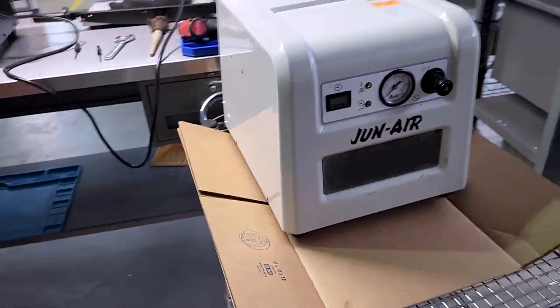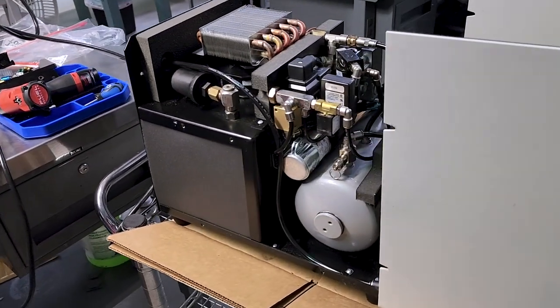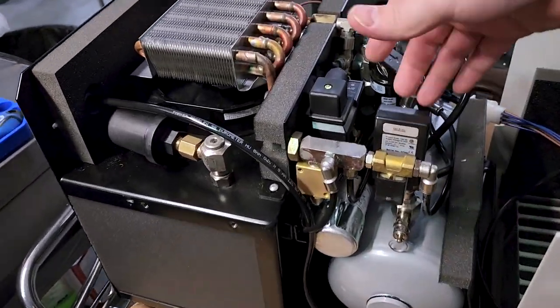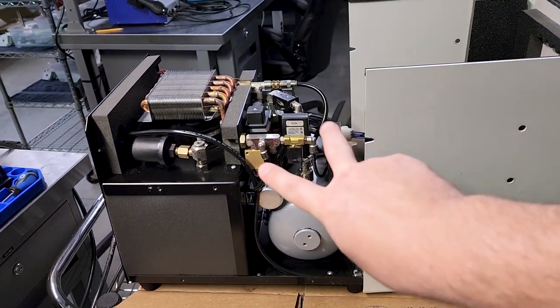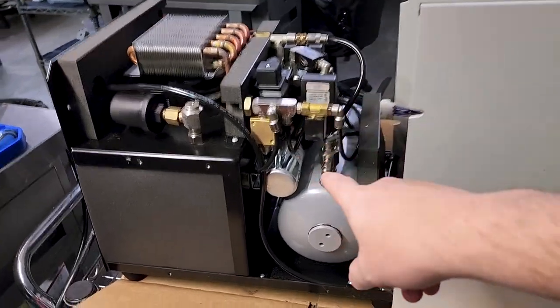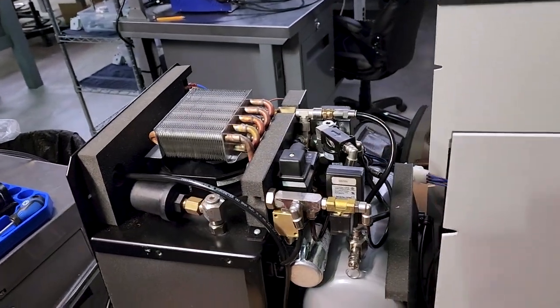So these are used in patient care environments because they're ultra quiet and because they are self-maintaining for the most part. When you turn one of these devices on, they have an auto purge cycle, which is controlled by these electronic solenoids up here in the top. It goes through this little cycle where it opens up one of them and closes the other one. And then as it purges a certain amount of moisture from this tank, it will close the one and start building pressure. And you can see all that on the gauge.